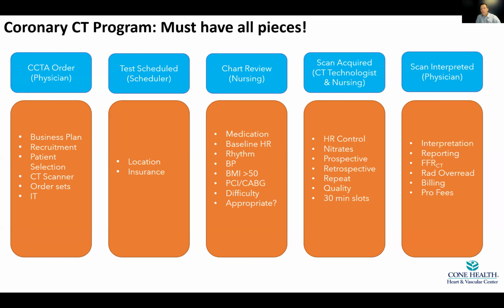And another key piece is the technologists, and the nurses are there as well. But the technologists have to recognize certain things: heart rates, arrhythmias. They have to know how to scan the patient. I'll talk later about some solutions for that, but it's just something you have to think about, especially when you want to optimize times on the scanner or increase your slot utilization on your current scanners.